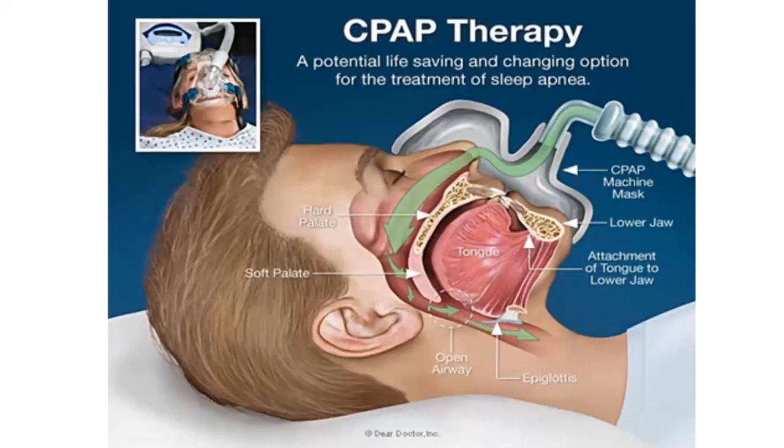You can see we can use CPAP, which provides continuous positive airway pressure to keep the airway and the epiglottis open to move the air into the lungs. Next slide, please.